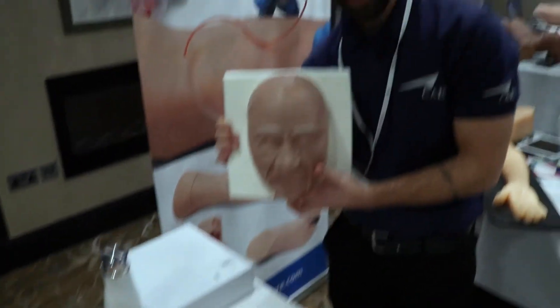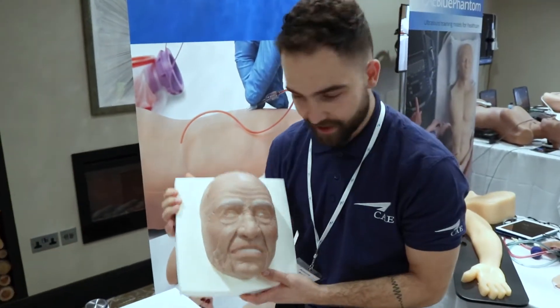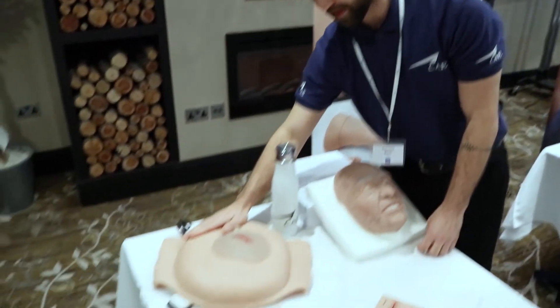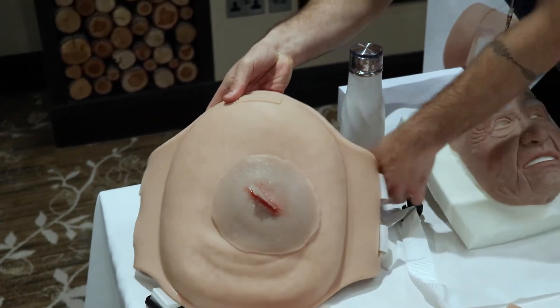Finally, we've got a beautiful mask here — this is Jerry, our geriatric mask that can fit perfectly on Iris and Juno. And we have this postpartum belly that you can wear on a mannequin or a standardized patient.